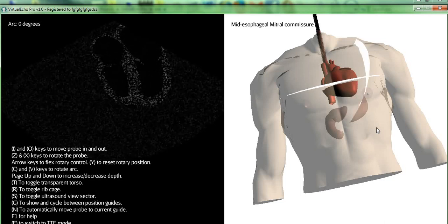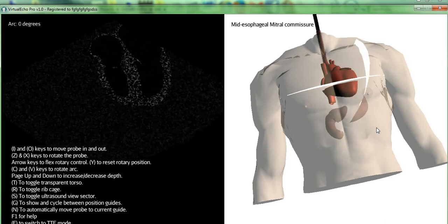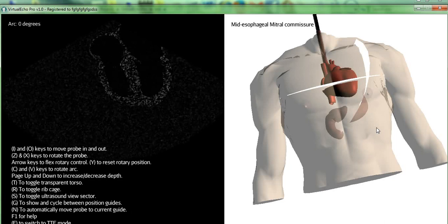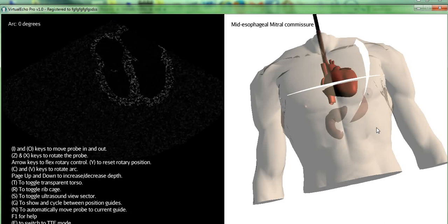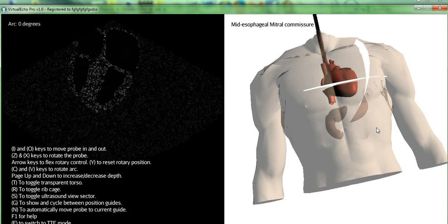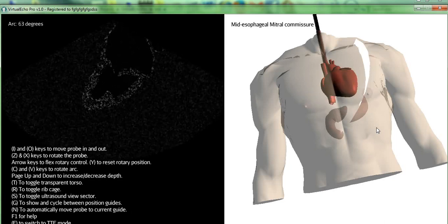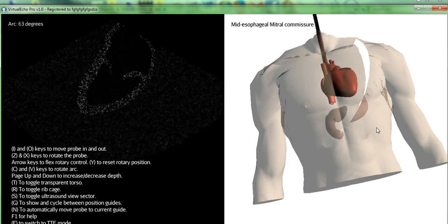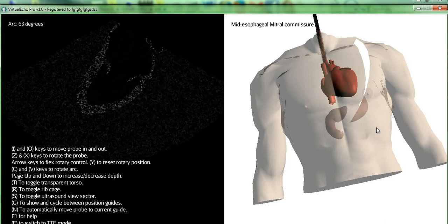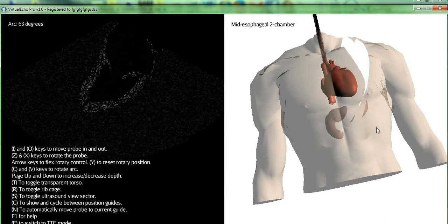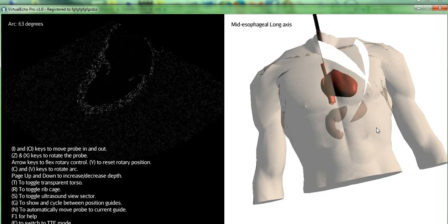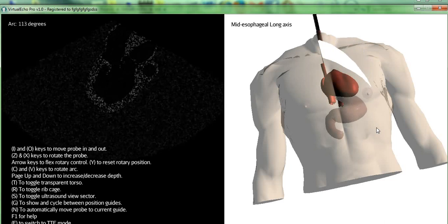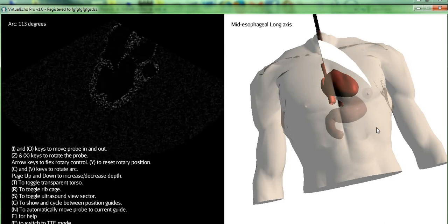Let's move to a different view, how about the mid-esophageal mitral commissure, and we press the N key. The probe will move until it aligns itself with the guides. Let's have another view. Like so.